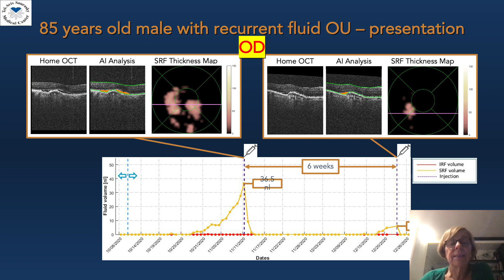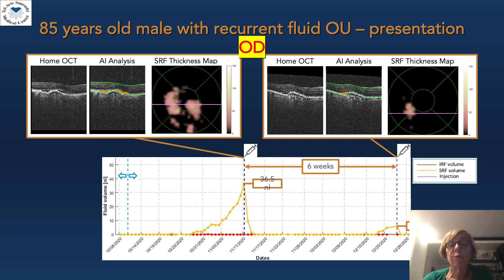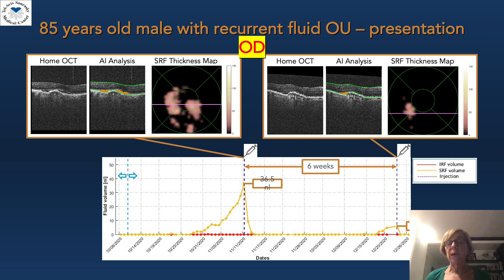Here you can see three months of follow-up with a home OCT in a patient with recurrent fluid in both eyes. In the right eye, there is presence of retinal fluid over 15 days leading up to the time of the pre-scheduled visit and fast resolution within three days, followed by a recurrence after 40 days prior to a pre-scheduled treatment visit. The fluid thickness map shows that leakage is confined to a smaller area and the graph shows the smaller sub-retinal fluid volume upon the second recurrence.